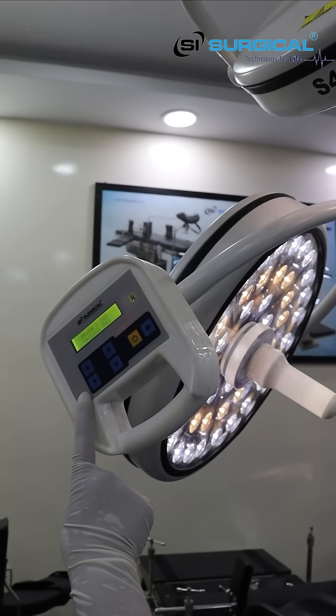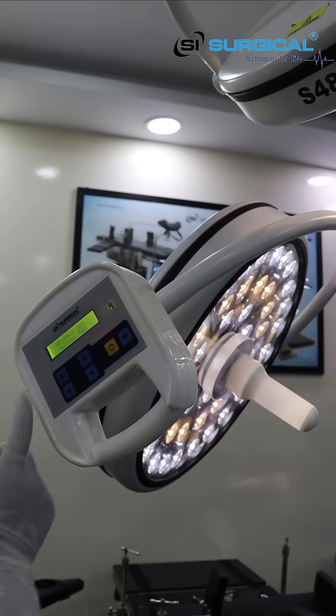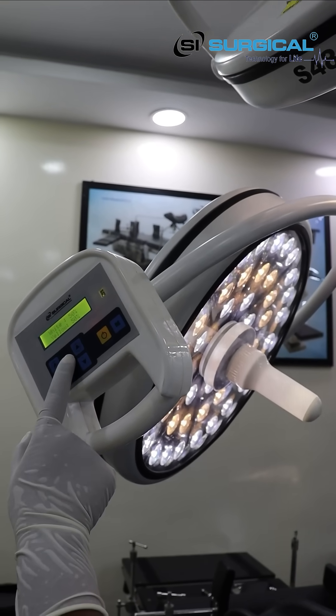These are the features: high to low for the OT light, this for white light, and this for yellow light. Let's go to our factory where we manufacture this OT light.